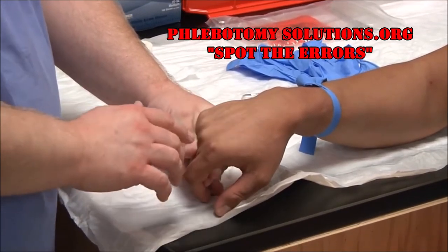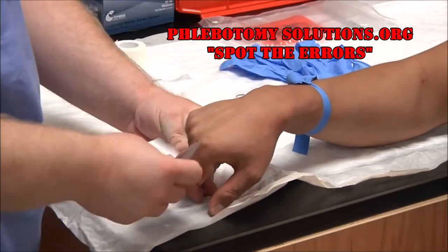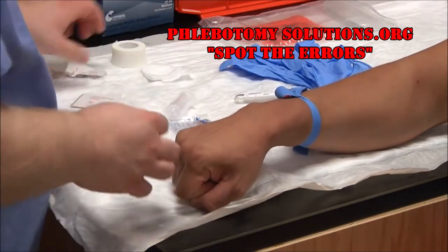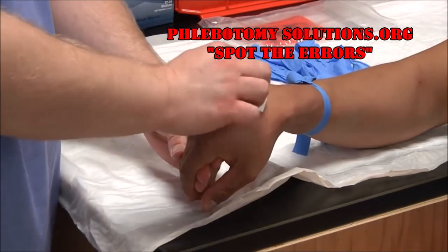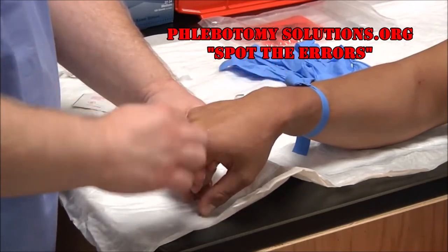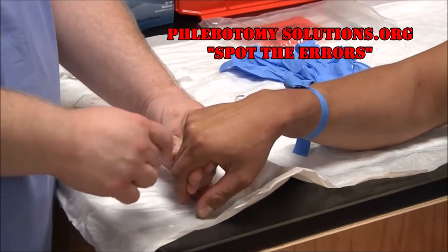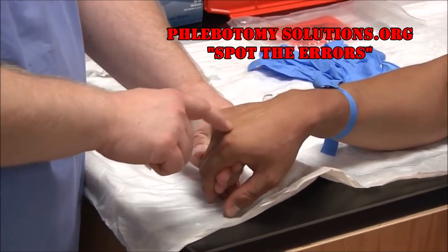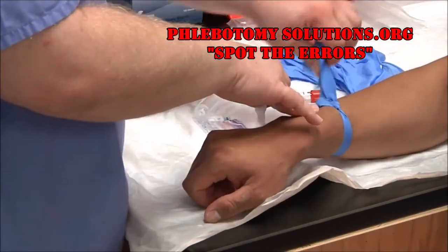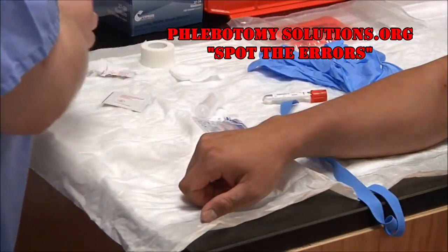If the patient's hand is bent and the veins are still not very visible, you can take an alcohol pad to help bring the veins out. Keep in mind, this does not count as cleansing your patient — it simply makes the veins more accessible. As you can see, the veins are popping right out. We'll then release the tourniquet, because as a new phlebotomist we cannot meet our 60-second goal.